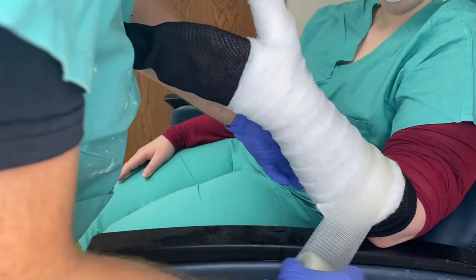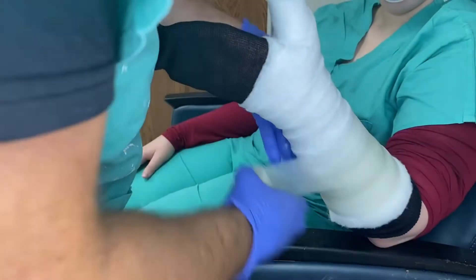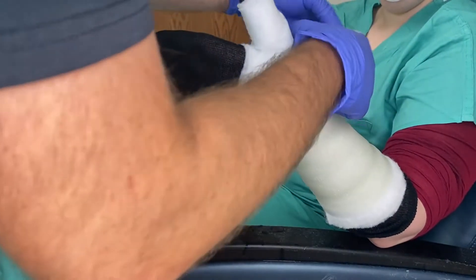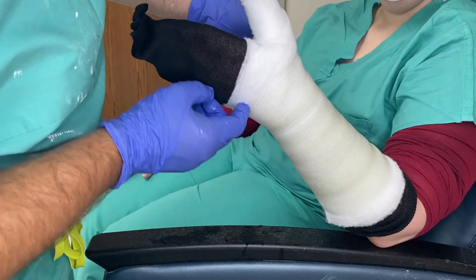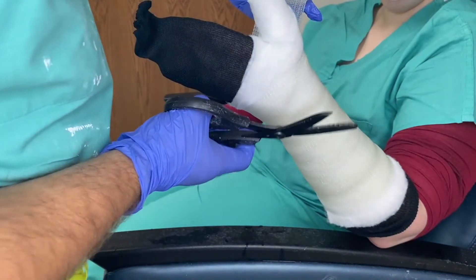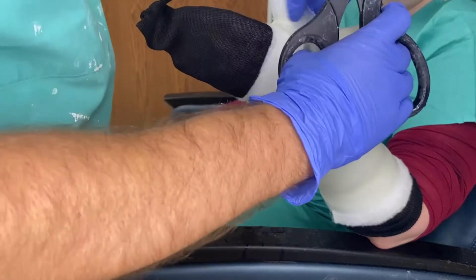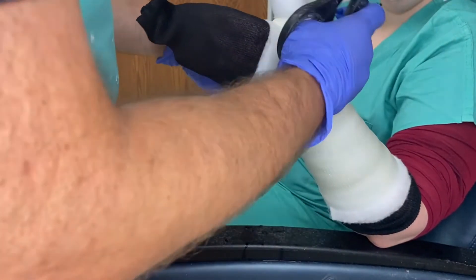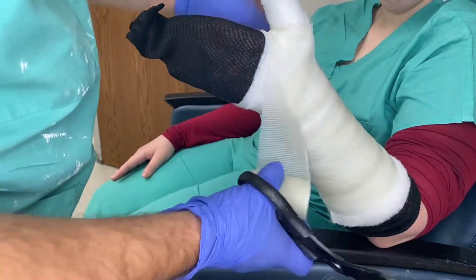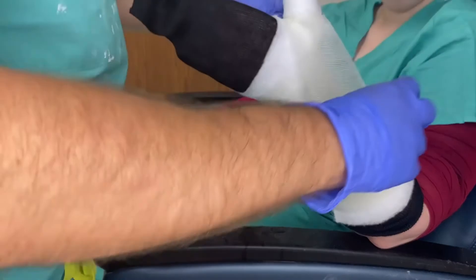To roll the fiberglass, start proximal — it doesn't matter which way you start as long as you do it right, getting nice even layers going up at 50-50. Go around the hand, making sure you have at least a quarter to half inch of cotton showing on the end. You want the palmar crease nice and free. Do a three-quarters cut and then go around the thumb. If the patient has a smaller web space, make a half-inch cut instead so you can tuck it in a little bit easier.